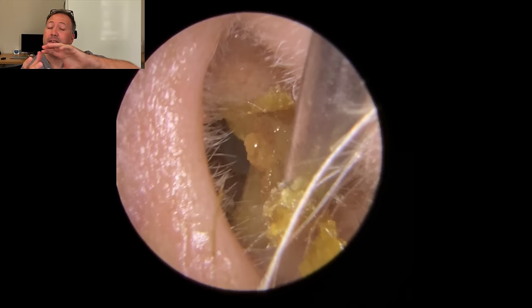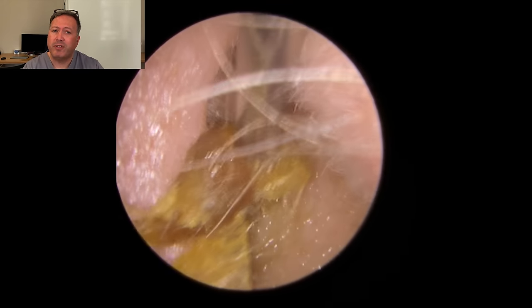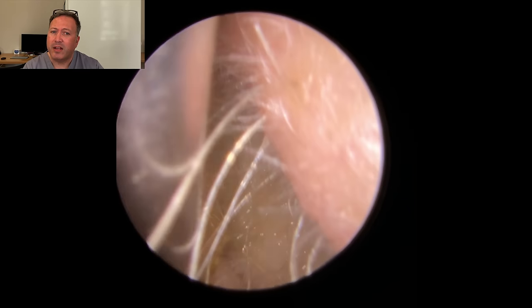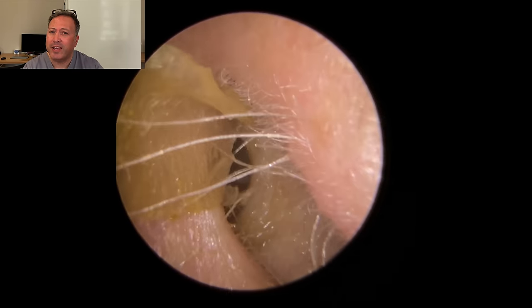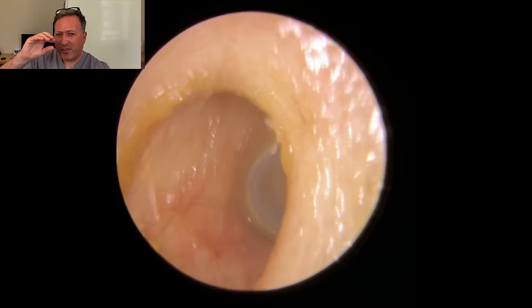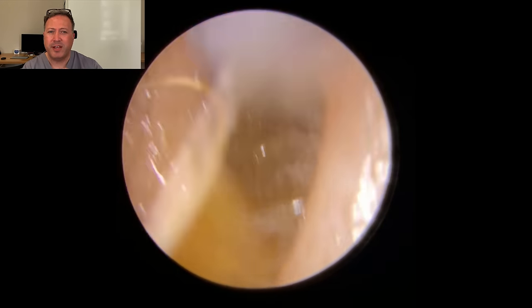So what's been happening here is this wax actually dried around the ribbon of skin. So I'm trying to work this out here. So just slowing the video down, trying to get a good grip on the skin behind. And as we pull this, you'll see that ribbon coming away there nicely. There we go. So you can see this long kind of thin tail of skin at the back of that wax there. There's the eardrum looking nice and healthy.